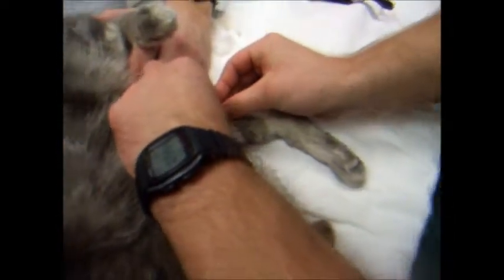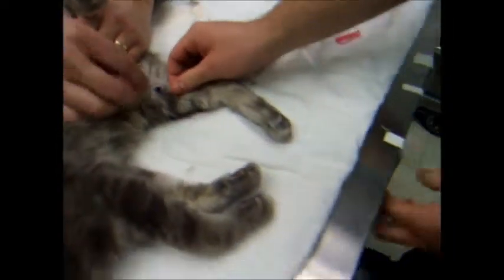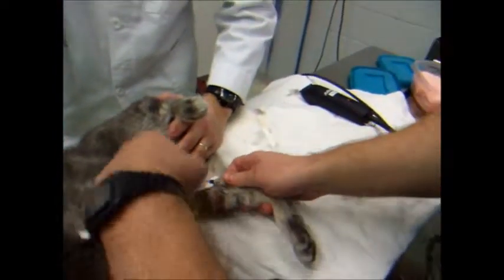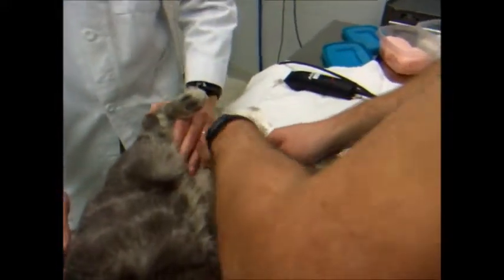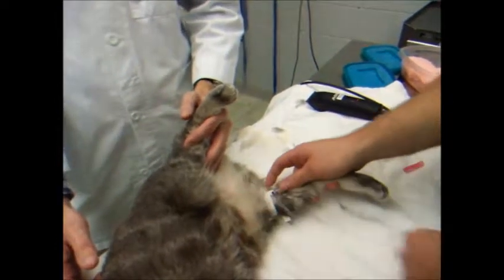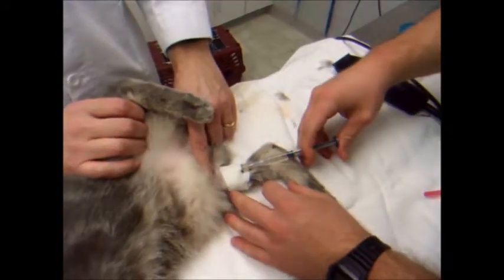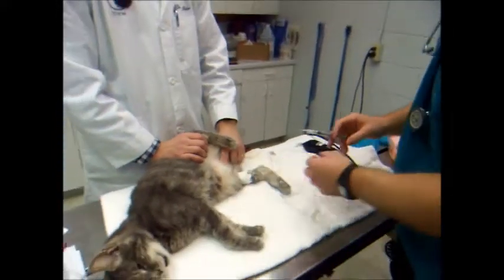I'm going to put a cap on there. And then we're going to tape it. Make sure it's nice and secure. I'm going to go ahead and flush it just to make sure that this catheter is actually in. Burke, if you don't mind holding your finger there. Feel it? Feels good.